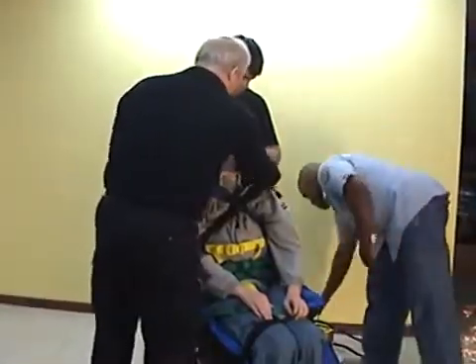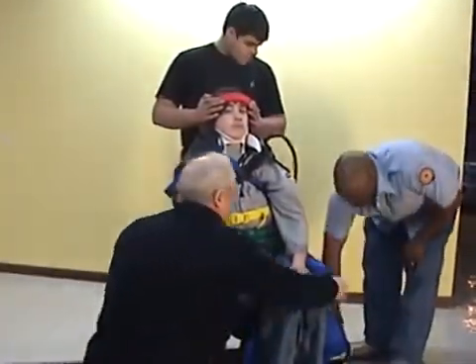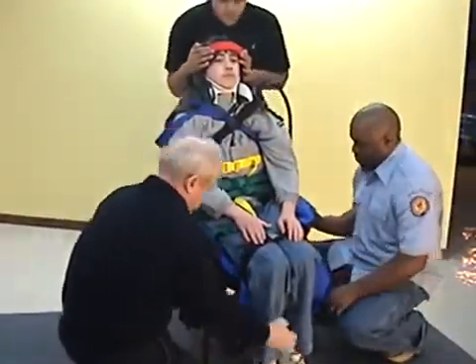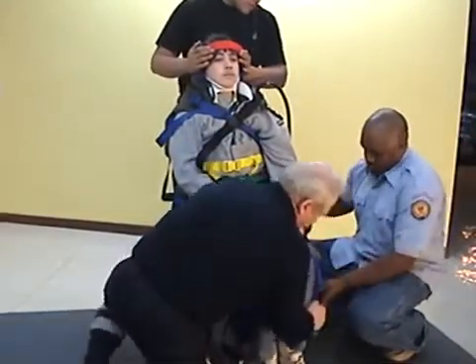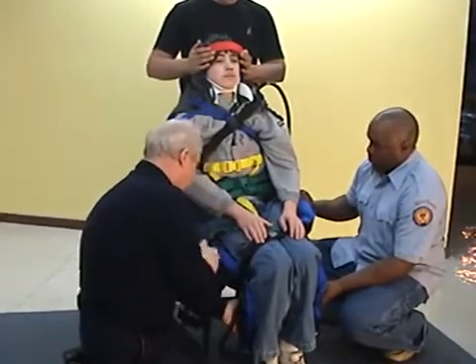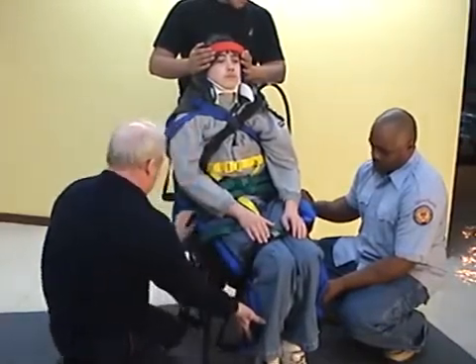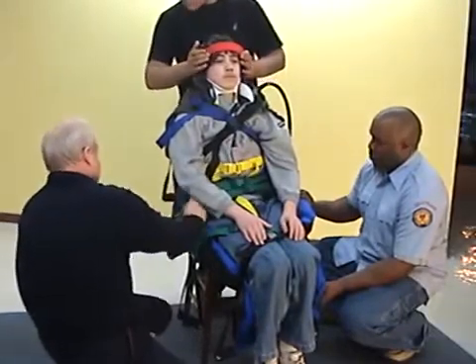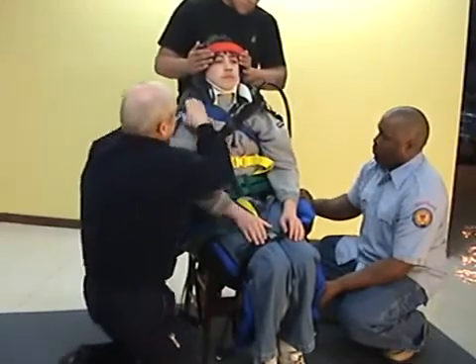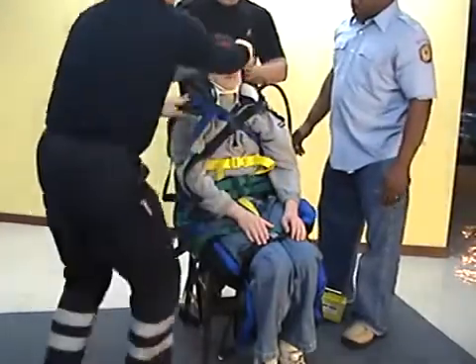Connect the pump and evacuate the air. Meanwhile, form the VSB around the patient. The more it is formed around the contours, the better the immobilization and support. Especially in the hip area, there should be great attention given to support. The more snug and formed the splint, the more comfortable your patient will be. The end result should look somewhat like a high back chair. Make sure to pump all the air out — it is not possible to pump too much. You will feel when the VSB is very firm. Then readjust the straps to be snug tight.